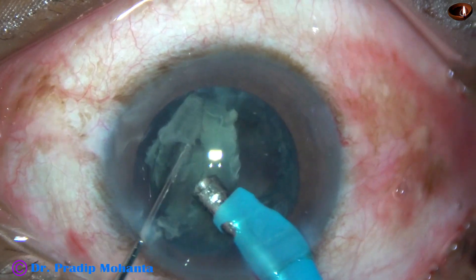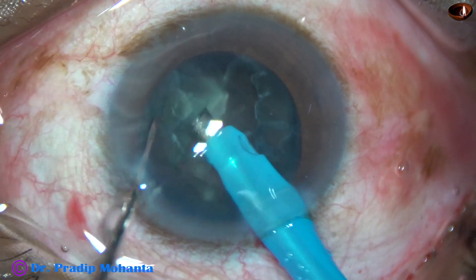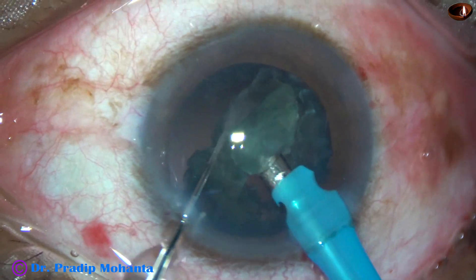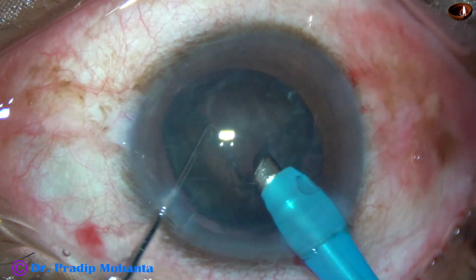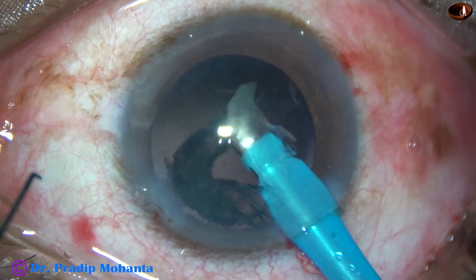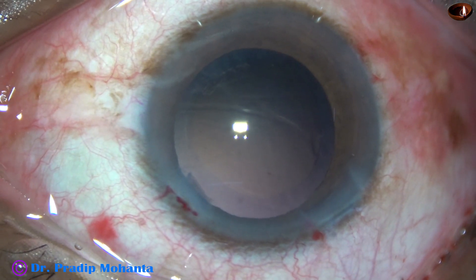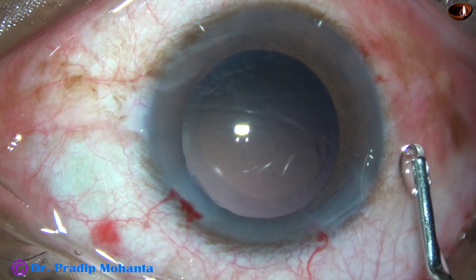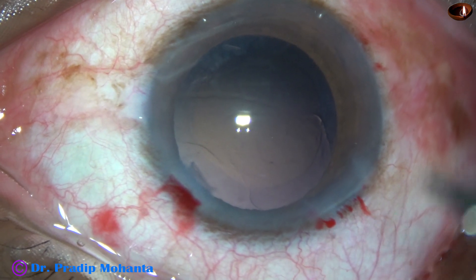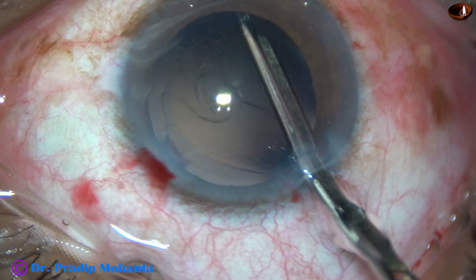And now this is the last bit of the nucleus. The nucleus as well as the epinucleus is removed. In this case we find that there is hardly any cortex — only a bit of cortex at 6 o'clock. The rest of the area, the bag is clean. So I take the Simcoe and remove the cortex from 6 o'clock.